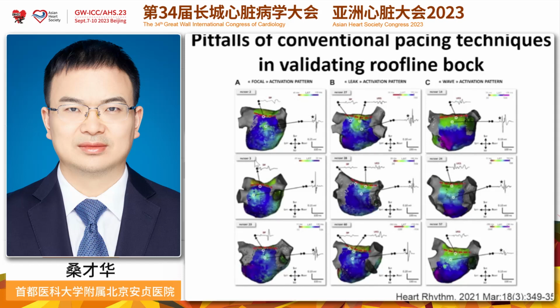You can see this patient, when pacing at the left atrial appendage, there is a breakthrough here. So why does this happen? Maybe there is epicardial conduction.